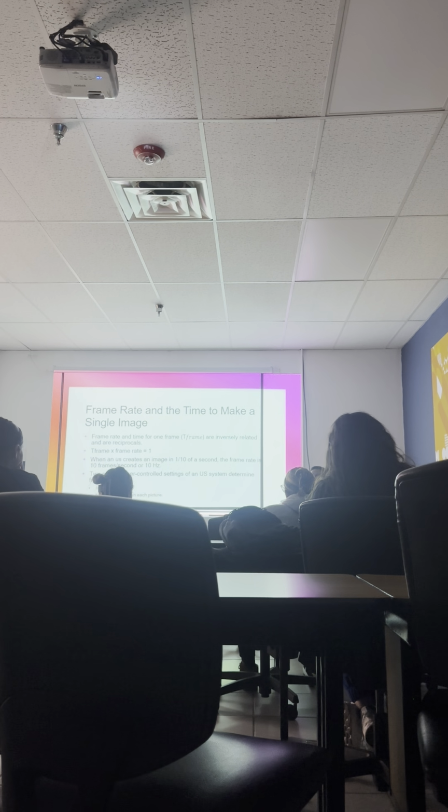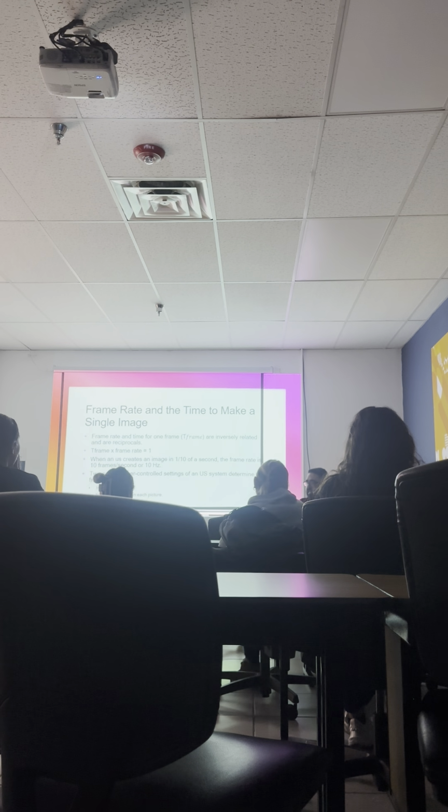But on the heart, we can't have that many scan lines, right? Because we need to make sure that our frame rate is as high as possible, so we can accurately see those flaps moving up and down. So our image isn't as great, but our frame rate is awesome. It's always a give and take. We can't always have everything that we want. Sometimes we have to give something to get something.